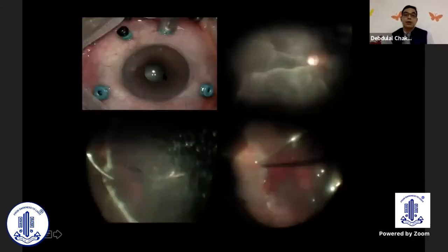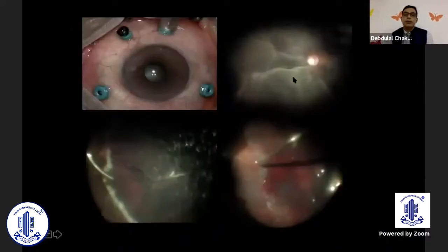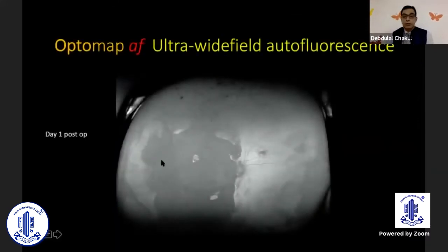This is the intraoperative capture of the pupillary size. And this is something that we did this Monday itself. And through this small pupil also, you can get a picture like this. So of course, we removed the subretinal blood through a temporal retinotomy, and we realized that there was a large RPE rip. And then this is day one post-op. This is on last Tuesday, we could capture this large RPE rip that was possible to see with this ultra-widefield autofluorescence with the Optos. So this was on day one.